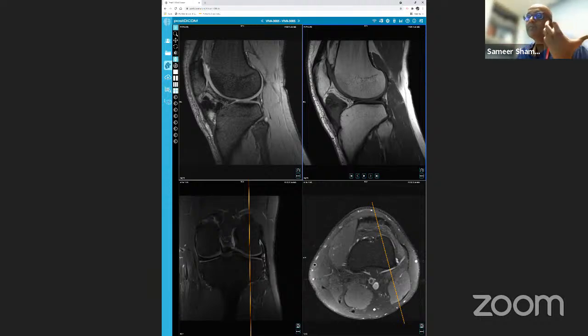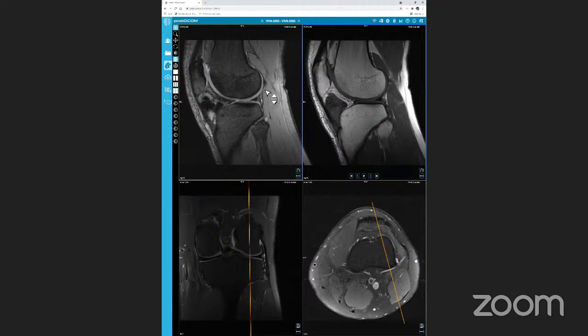But it's the degree of blooming that is more important. So in terms of the degree of blooming, if you take a scale of 0 to 100, I would say calcium would bloom around 10, gas would bloom around 20, and blood will bloom around 60%. And then you have metal, it will bloom 100%. It's the most blooming. So these are the 4 different blooming you can get. Yes. So now what are your differential diagnoses here?